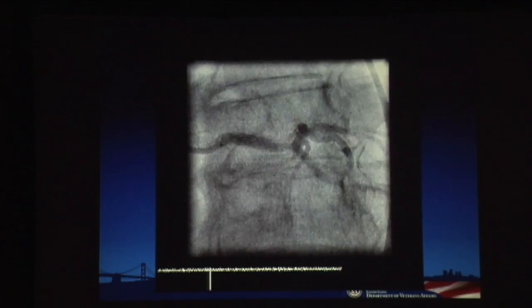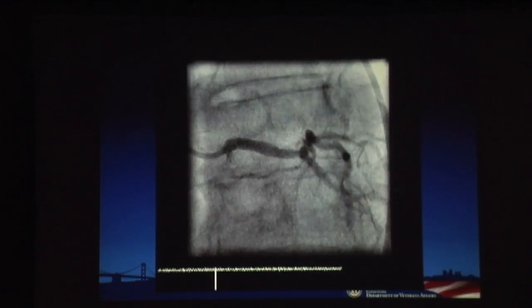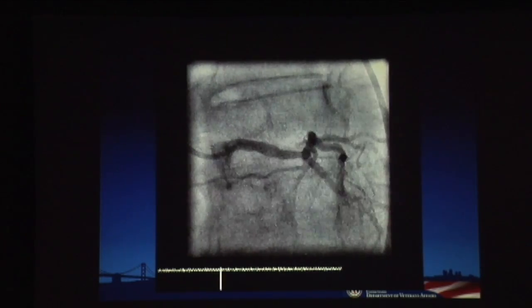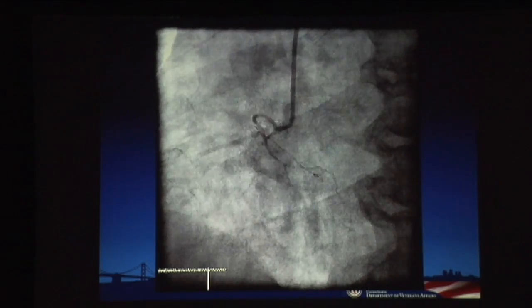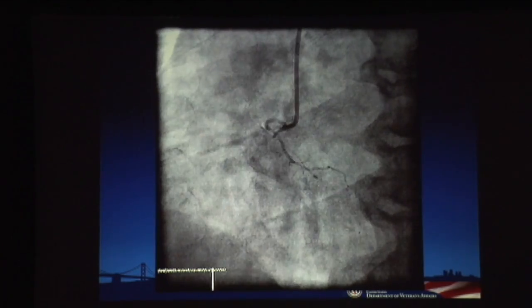And so, this is a really sick guy, lots of comorbidities. Take a couple more pictures, and the distal lesion, you're trying to convince yourself. I love that comment that Sunil made about how the indications should not be dictated by the difficulty of the procedure. And I think sometimes even the angiographic reads are influenced by how sick the patient is and how reluctant we might be to do something for him. But at any rate, I think it's fair enough to say that lesion was somewhat indeterminate.